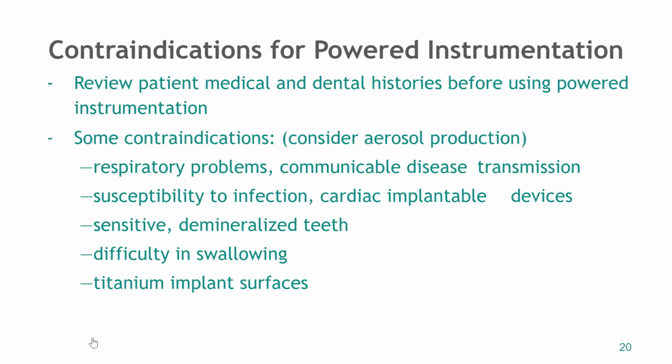So, contraindications for powered instrumentation. It's important to review the patient's medical and dental histories before using powered instrumentation, especially if your office has a really, really old Cavitron. The older ultrasonic instrumentation devices were not shielded and could cause problems with pacemakers. But now the pacemakers are shielded, and typically so are our instruments. So that's not really a contraindication anymore.